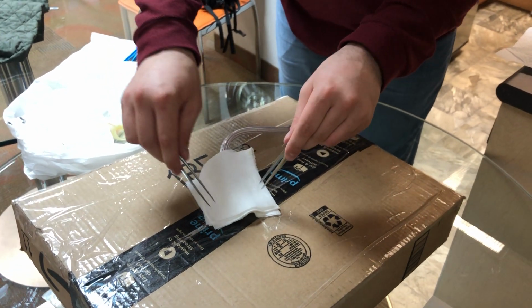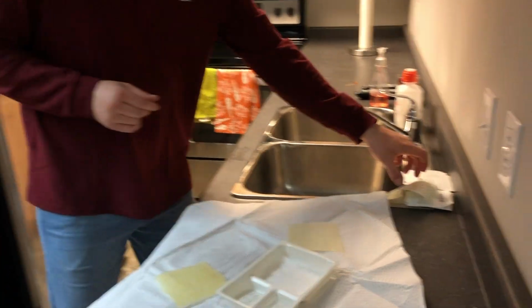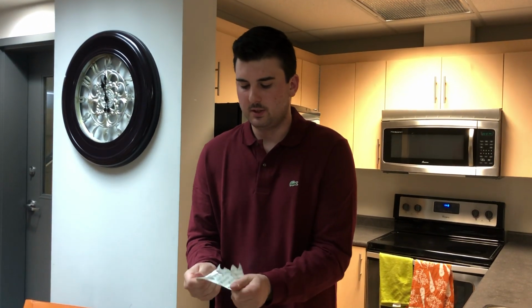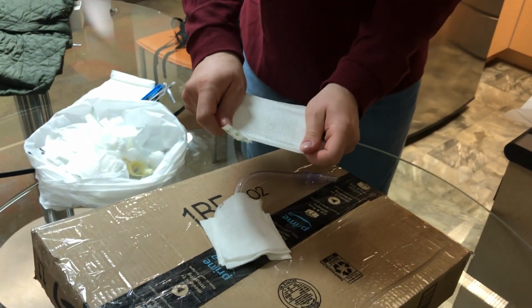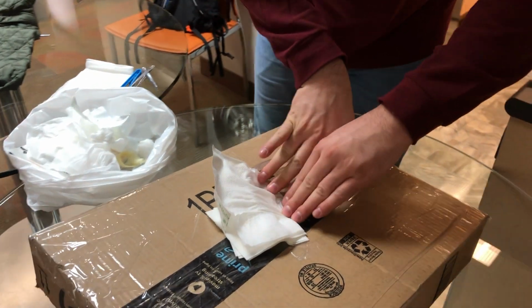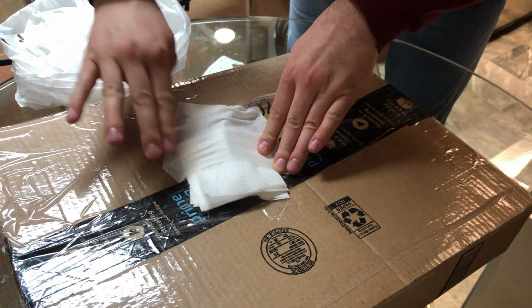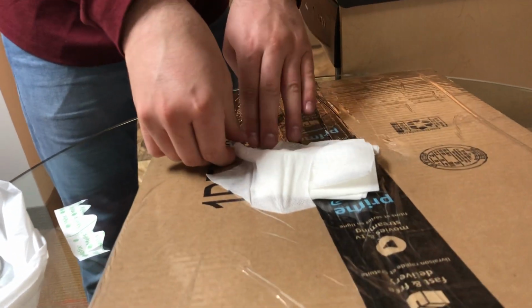And finally, we can add our 4x4 gauze over top. And I can put these in the sharps bin. Don't need them anymore. We're done with our sterile field here. We just have 2 pieces of Mefix that we will secure. So you kind of stretch it apart, like so. Secure it to one side. Pull the other part. And you can actually tent the Mefix there to add some extra securement of the tubing so it's not moving around quite as much.